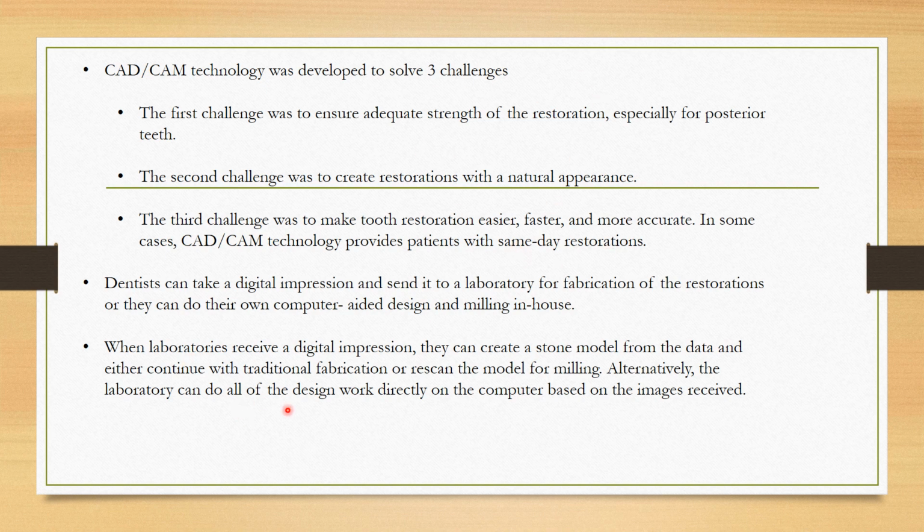So a dentist can take a digital impression and send it to the lab, and if there is a lab associated which does the CAD-CAM work, it can be sent to that lab, or a dentist can also own a CAD-CAM and a milling machine in-house, so he can have a lab with all the facilities.